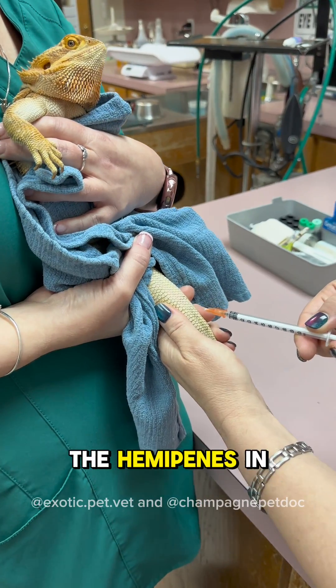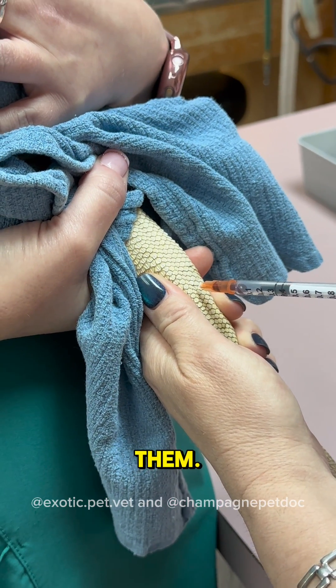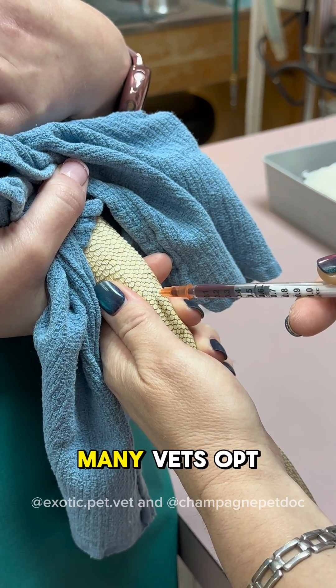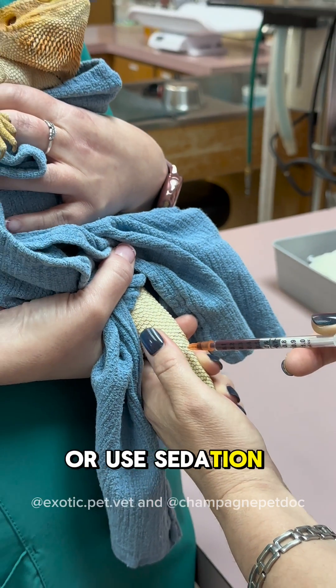It's important to be aware of the hemipenes in male lizards and to draw from far enough down the tail to not damage them. Caution must be taken in any species that experiences tail autotomy, or dropping of the tail when stressed. Many vets opt for other locations in species such as leopard geckos and iguanas, or use sedation first.